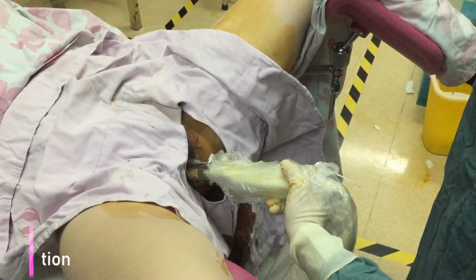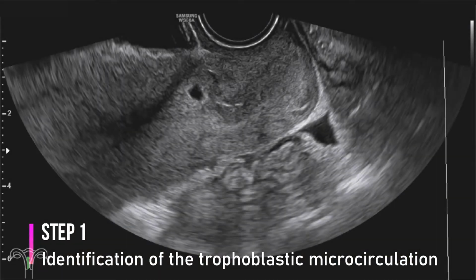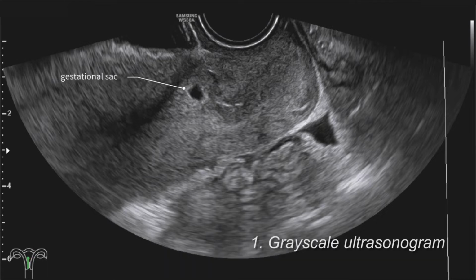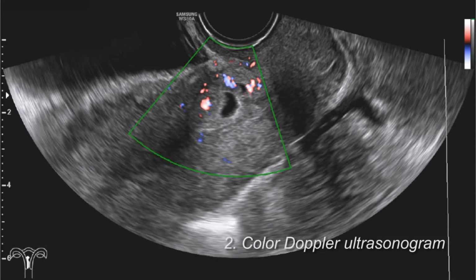Step 1. With the patient in the lithotomy position, a transvaginal grayscale ultrasound was performed to locate the cesarean scar pregnancy lesion. The gestational sac with the yolk sac was embedded in a hysterotomy scar with an empty uterine cavity and a closed and empty endocervical canal. Then, a color Doppler ultrasonogram revealed rich blood flow around the gestational sac.